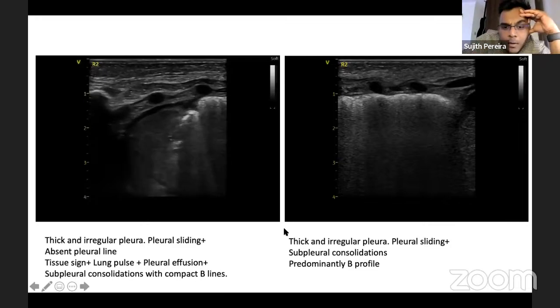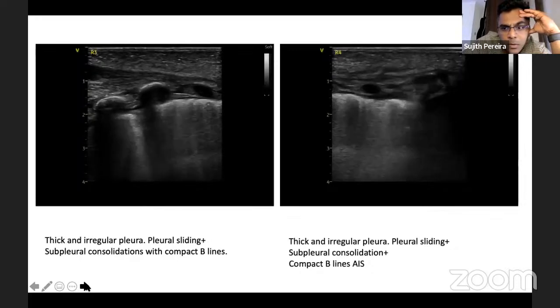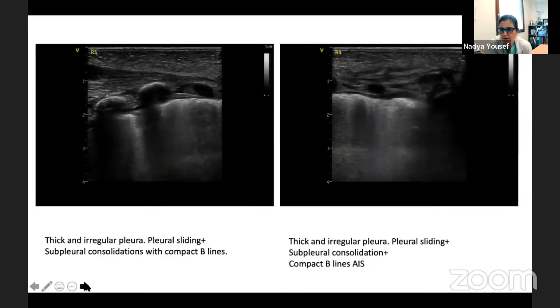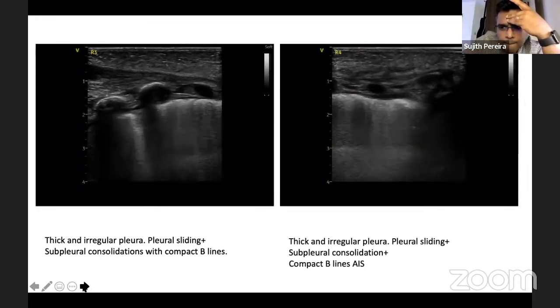Yeah. Could we move on to the next slide, please? Let me go to R2. So I'm not sure if this is just the frame rate on our Zoom, but from what I see here, we can see there's lung sliding, but R4 is becoming more fuzzy. So I don't know if it's a question of the frame rates or a question of settings on your machine, because you did say at some point it was difficult to see sliding, although there was movement. So I was wondering whether it also had something to do with settings, but of course the pleural line is extremely irregular all over with small consolidations.